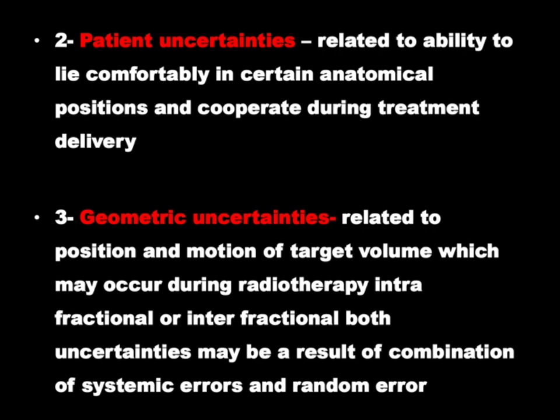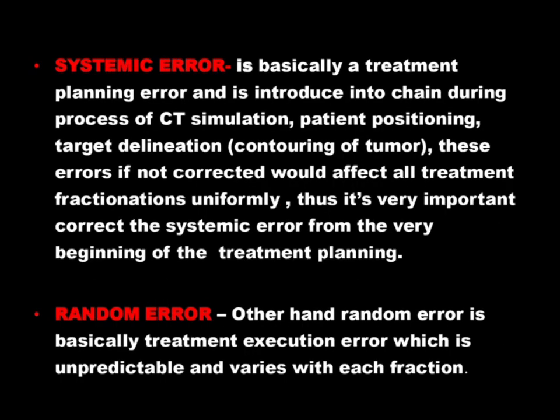So the basic concept of image guidance in radiotherapy planning: the traditional radiotherapy carries a disadvantage of making a significant number of assumptions in its technique. That is, we cannot assume that the tumor movement is fixed. For every individual, the extent of tumor movement is different.